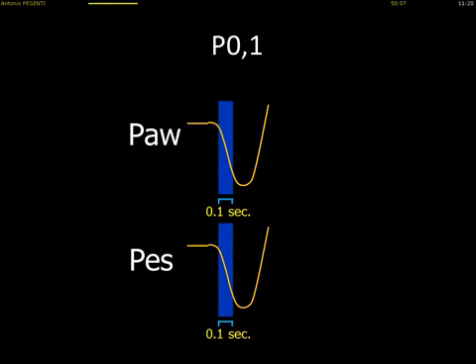And you can measure it in the airways or in the esophagus. Obviously, it's much easier to measure it in the airways. You make an end expiratory occlusion without the patient knowing it, and the airway pressure will go down at a speed higher the respiratory drive of the patient.